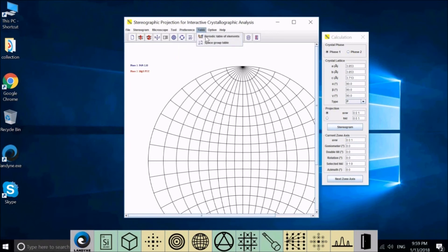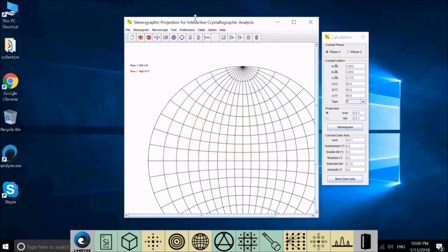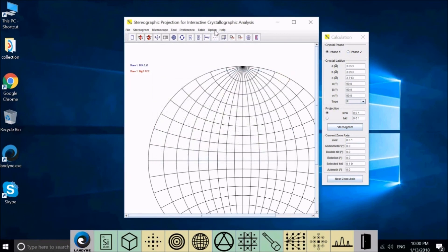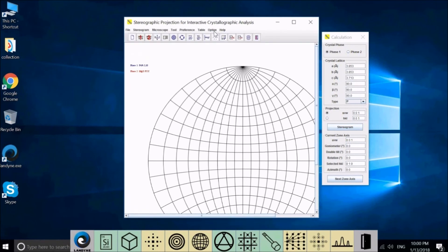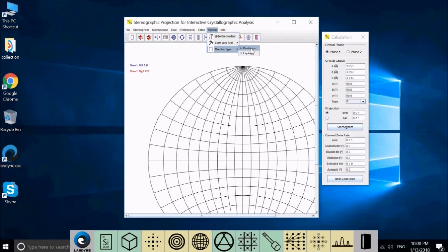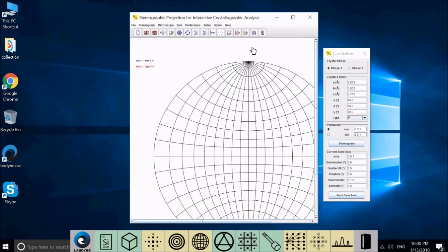In Table, we have a periodic table of the elements and we also have the table for space groups. In Options, you can hide or show the toolbar, and you can change the look and feel of the window. You have three choices here. And you can also change the monitor size for desktop or laptop.